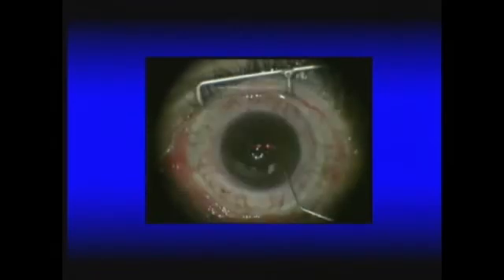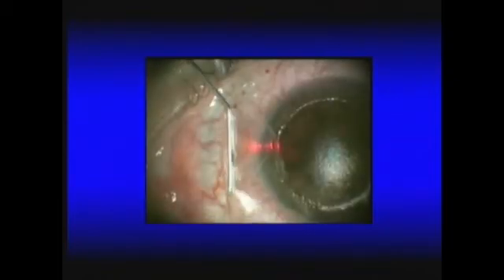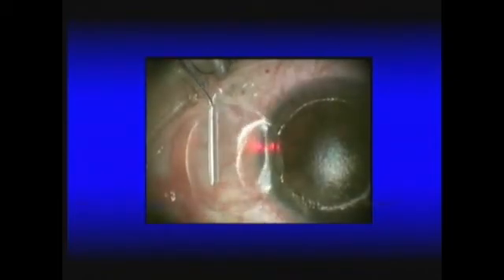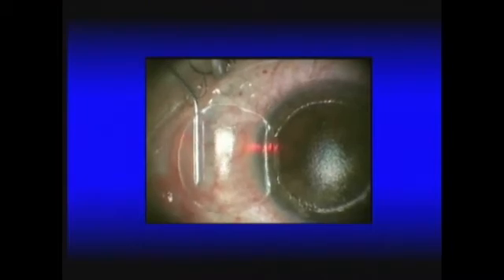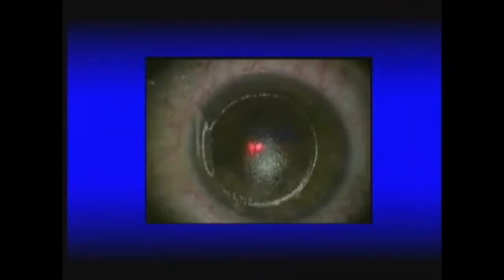So the Moria company manufactured the microkeratome with fixed plate with 100 microns. So that's avoiding ectasias. Manual microkeratomes, and with the flap manipulator, you see that it has just epithelium, Bowman, and a very thin layer of stroma, anterior stroma.